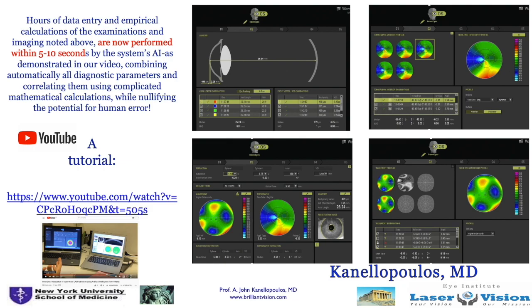Then on the top right, we're seeing consecutive Pentacam measurements, and there's a certain protocol on how similar and homogeneous these measurements need to be in order to be accepted as a go-to by the device, and so on with the wavefront measurements as well. Also during these measurements, iris recognition and pupillometry measurements are taken.